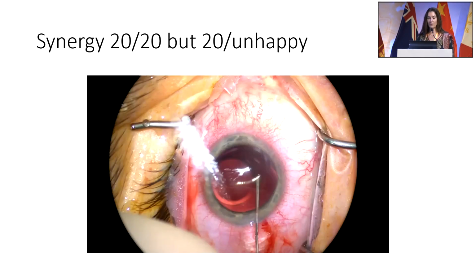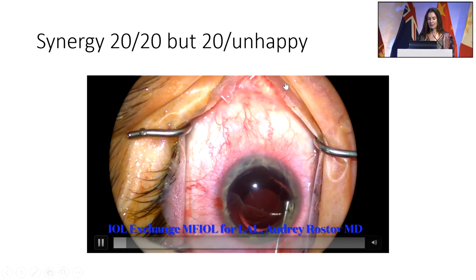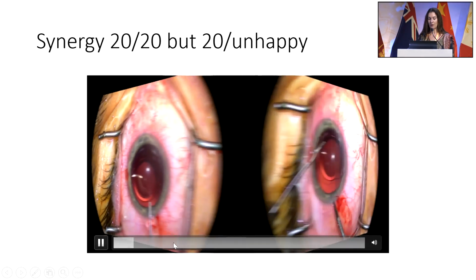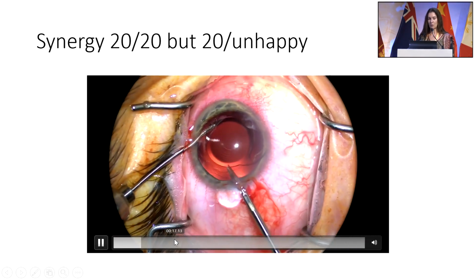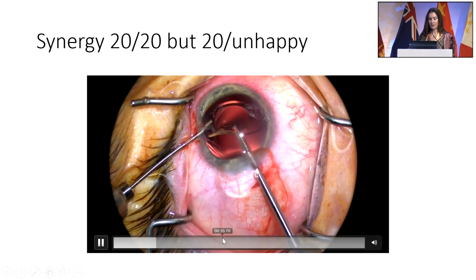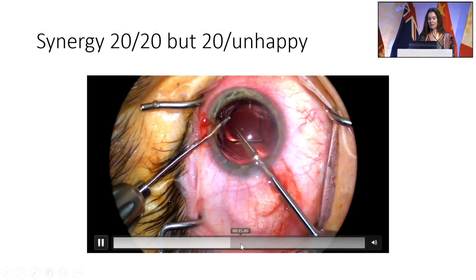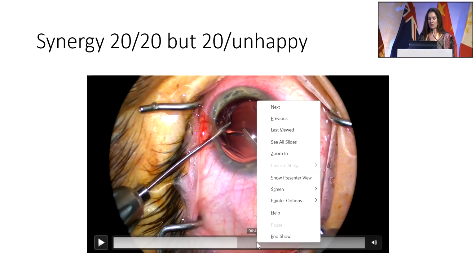And so for both of these patients, what I ended up doing was an IOL exchange. I exchanged the multifocal for a light adjustable lens. I know that you don't quite have that technology, I think, or maybe you're just getting it here. But essentially, when I do my IOL exchanges, I like to cut the lens. I don't cut all the way through, I just cut partially.